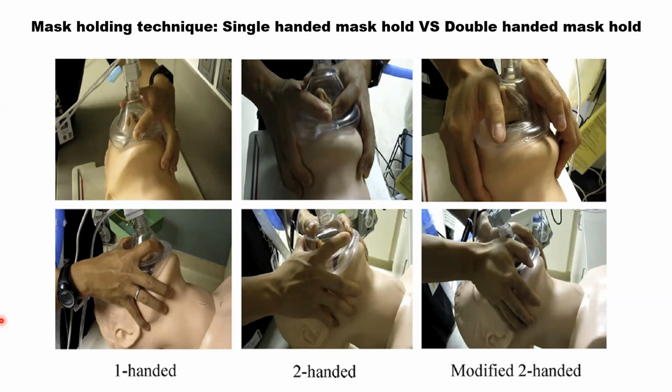Is it wrong if it touches like this? You can't remember. Like that. Then you put in another one, lubricant everywhere. Where is the lubricant? There's no gel. Like that, lubricant is fine. So now instead of needing to use so much of your energy and effort to open up the airway, the OPA and the NPA are going to help you. So the airway patency is ensured.